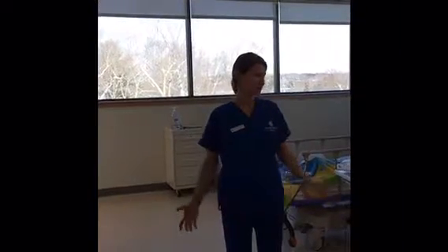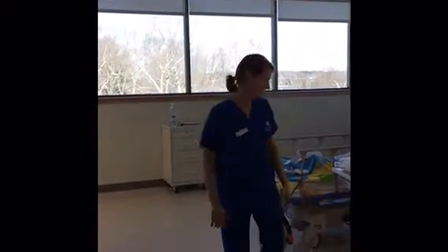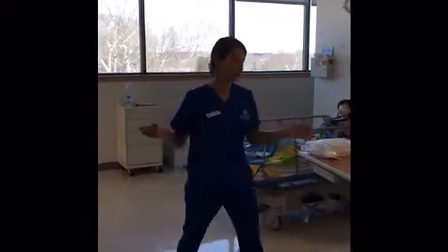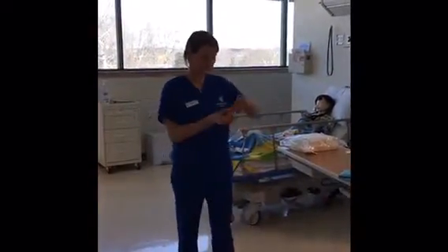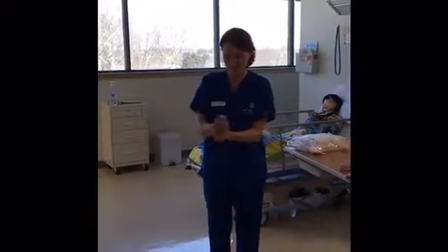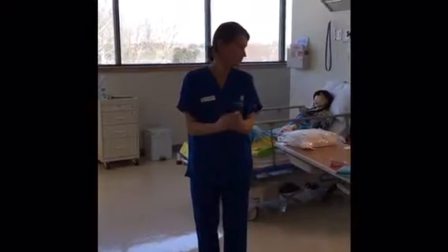Hello, this is Gantara. I am doing my Foley video validation. I am washing my hands, but for the purpose of this video, I'm using hand sanitizer because there was no sink in that room.